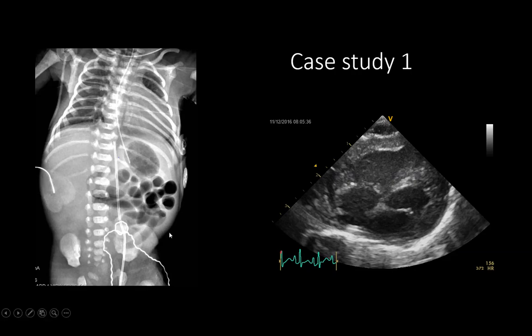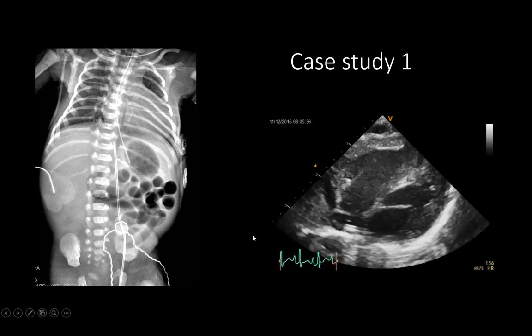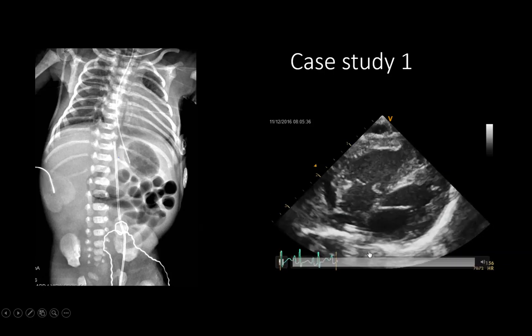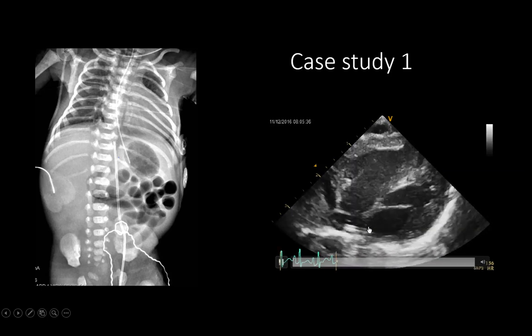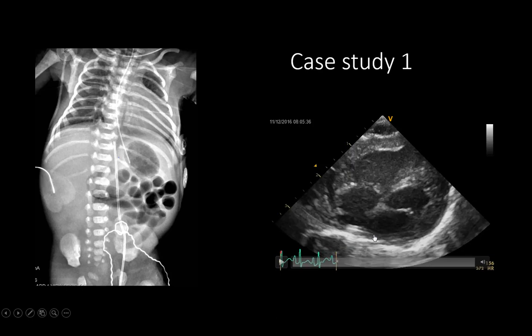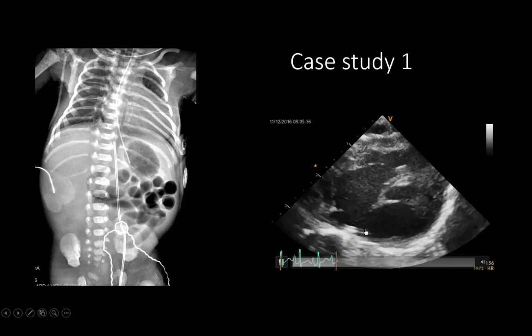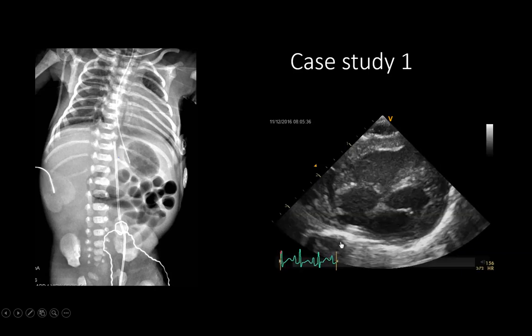In the first example, a 26-weeker with respiratory distress syndrome had a UVC inserted with the tip located between T9 and T10 on X-ray. Before manipulating the catheter, bedside ultrasound showed the tip entering the right atrium and crossing towards the inter-atrial septum. Even at T9–T10, the catheter was found deep inside the heart and needed to be pulled back.